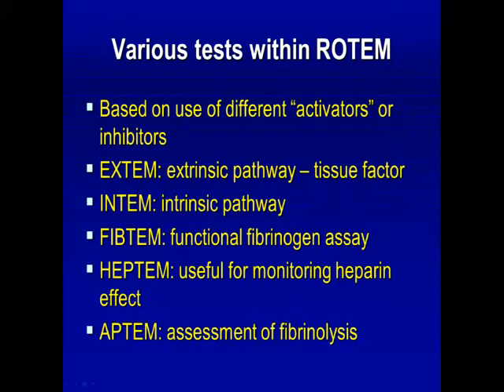And one specific test that will tell you about reversibility in fibrinolysis and therapy in fibrinolysis is the APTEM. The AP stands for aprotinin, which they add to reverse it. So if it corrects, then you kind of know that there's some fibrinolysis going on, but you would probably give TXA rather than aprotinin these days.